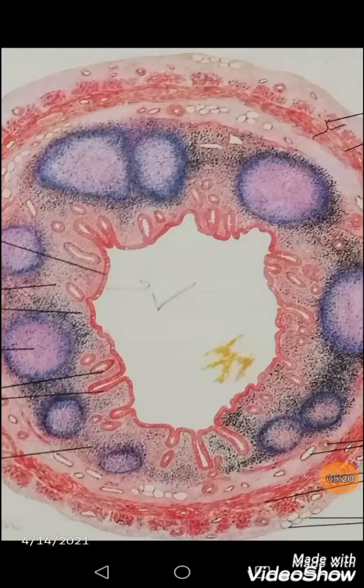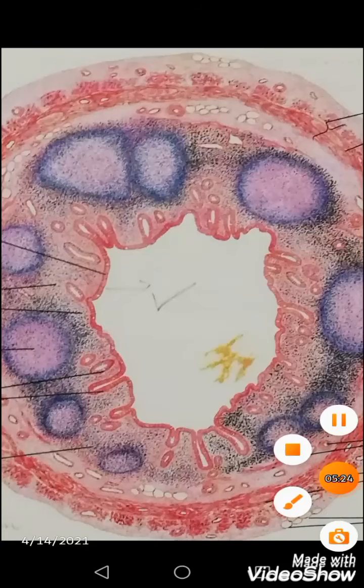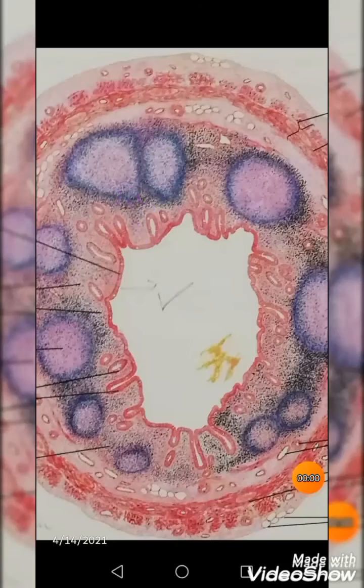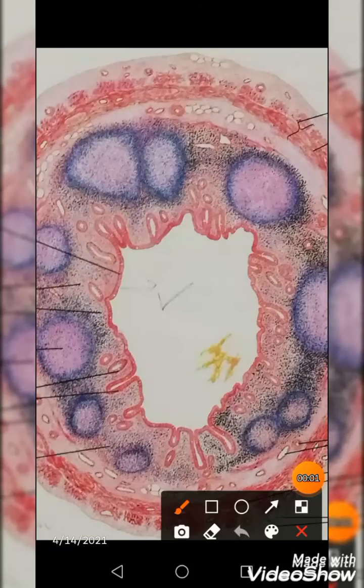Now you can concentrate on what comes after the lumen: its lamina propria is marked with very large lymphatic nodules. Again you have to concentrate on the lymphatic nodules which are present in its lamina propria, or you would say they arise in the lamina propria, and they are showing the germinal center, but they do not confine themselves to the lamina propria.